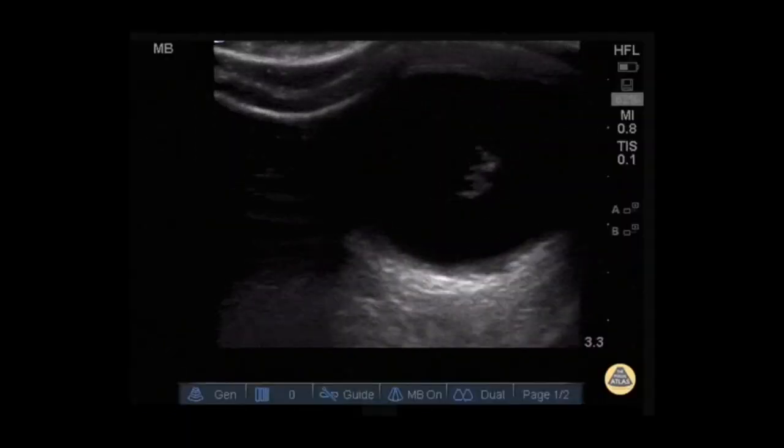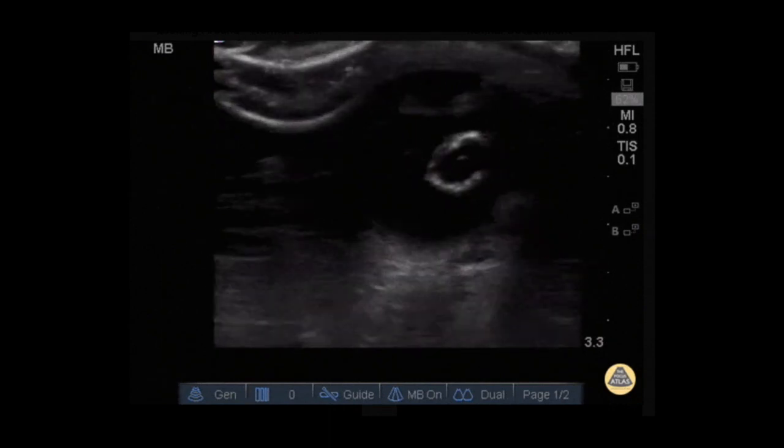So again, this is usually due to trauma. It could also be spontaneous in people with something like a connective tissue disorder. And here's a video of it taken from the POCUS Atlas.